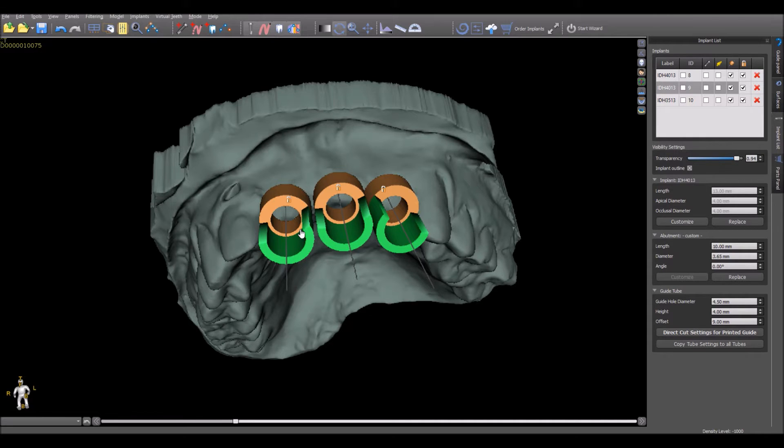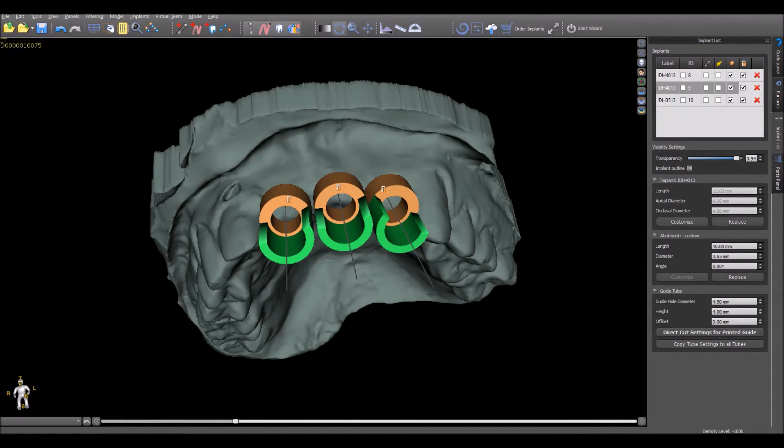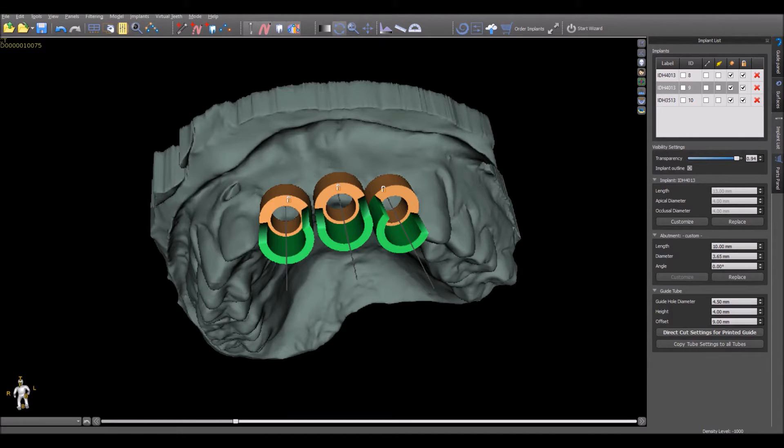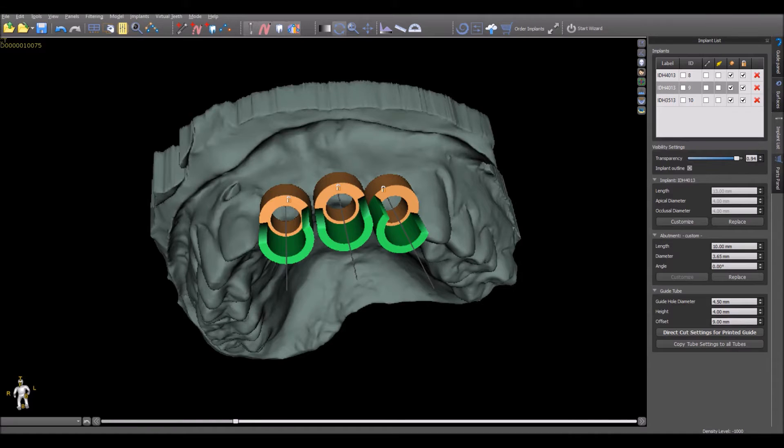The height of the drill stop is automatically determined by the software for users using the Blue Sky Bio X-Cube handpiece and the Blue Sky Bio long and short drills. We'll see in just a minute that the default settings can be changed if the user is using a different handpiece or wants to determine their own drill stop lengths.